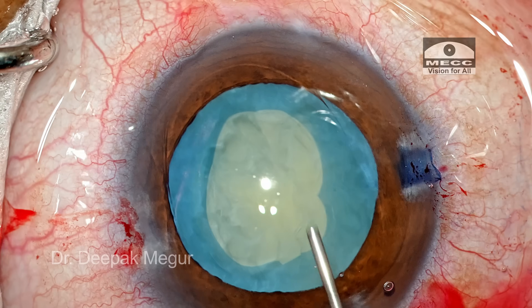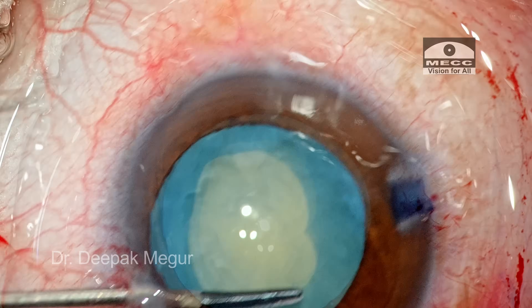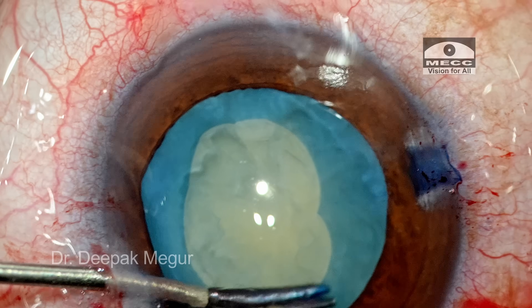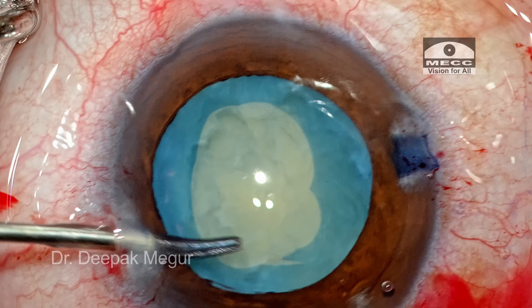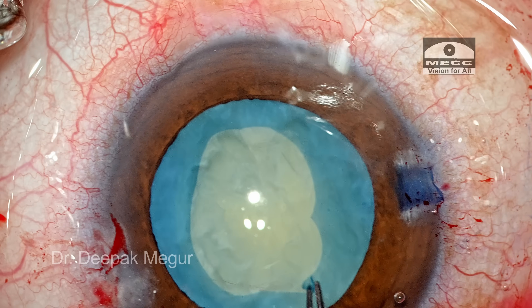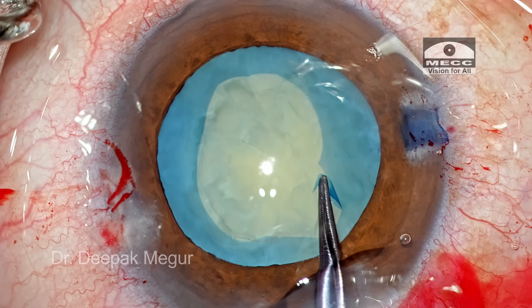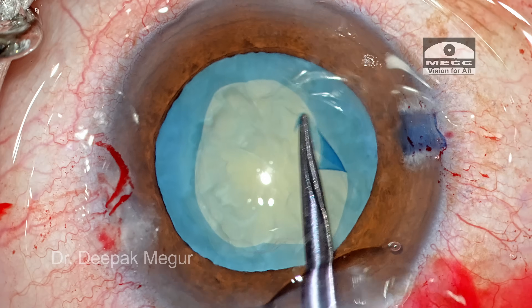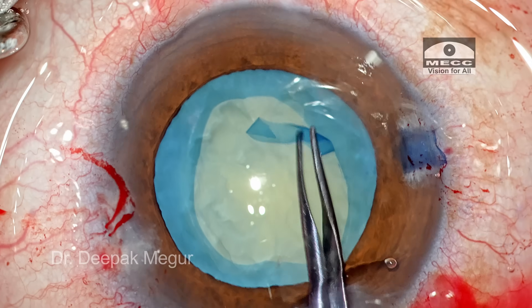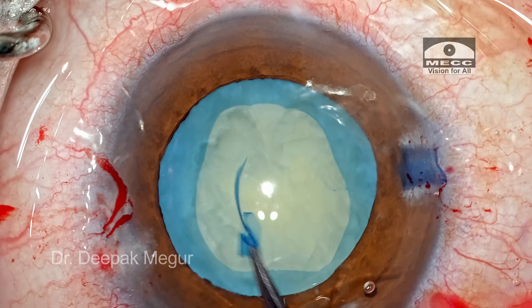Now we have a decent capsular opening. I want to do the enlargement on the other side of the capsule as well. The micro-scissors is used from the other side port to give a small nick, and then I go in through the main incision and use the forceps to enlarge the capsular opening on the other side. The capsule is folded and a small strip of the anterior capsule is torn off, resulting in an enlarged capsular opening.